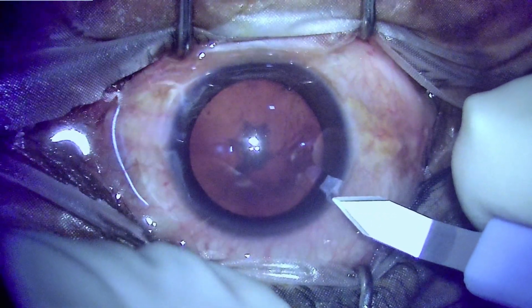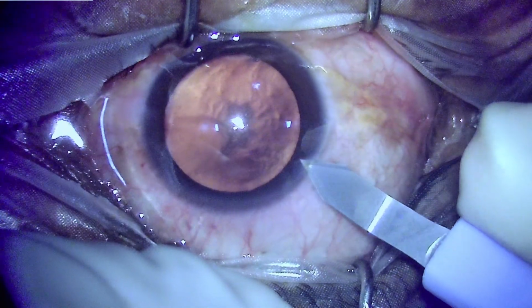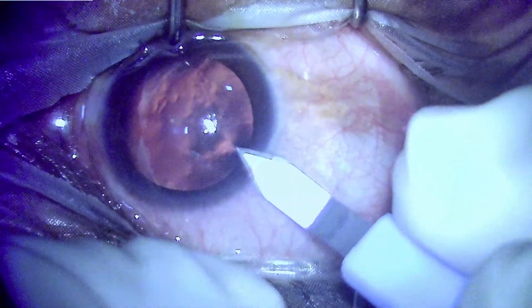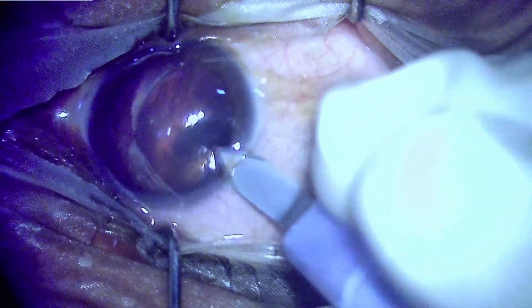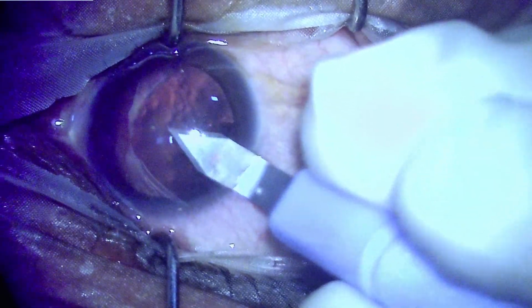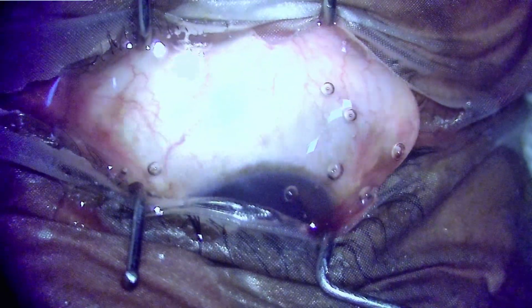Now because this was nearly a posterior subcapsular cataract, there was good retroillumination glow present. So I increased the retroillumination setting of the microscope and dimmed the oblique illumination. So nearly the whole of the surgery was done under this retroillumination only.